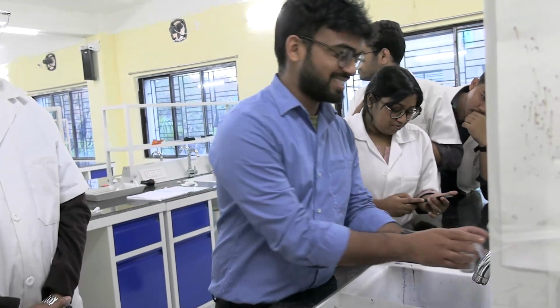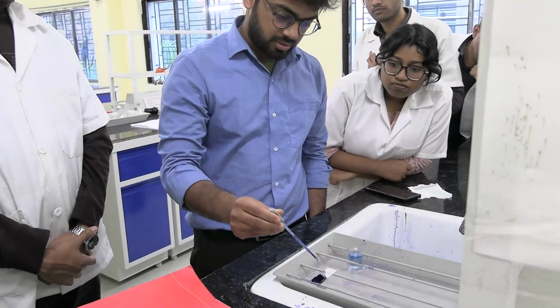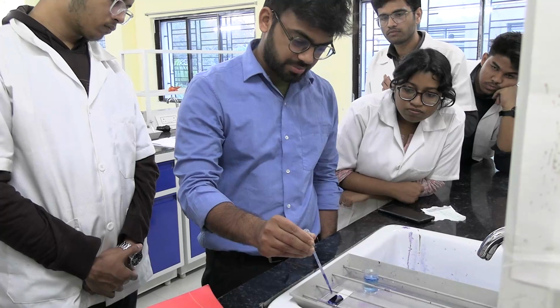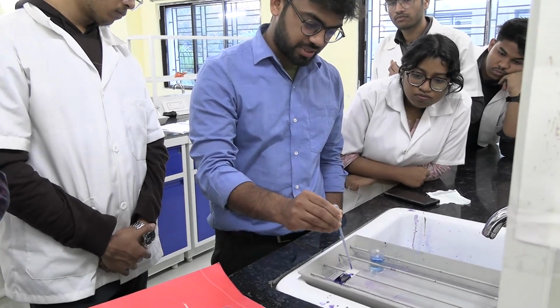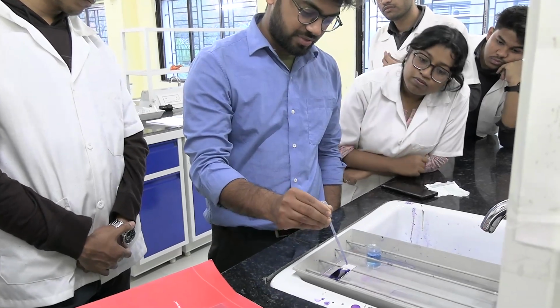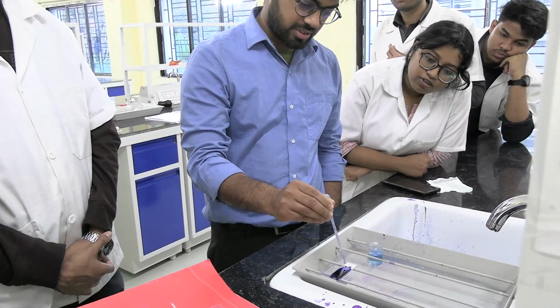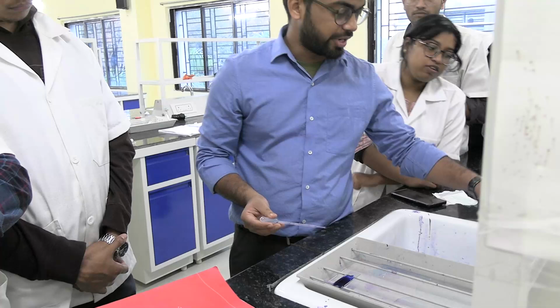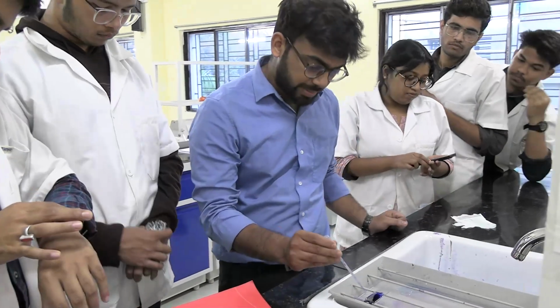Pause. How much? 1, 2, 3, 4, 5, 6, 7, 8, 9, 10, 11, 12, 13, 14, 16, 17, 18, 19, 20. Okay, now what will you do? Wait for 10 minutes. Set the timer, and remember to test the timer.